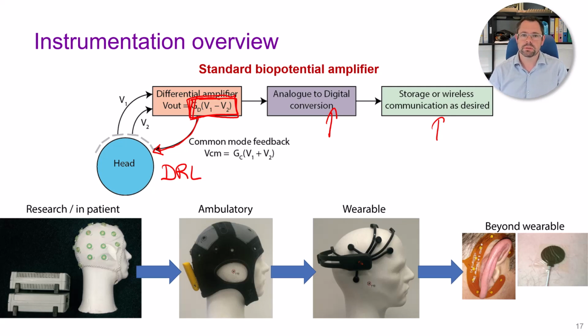The net result of that is that to set up a basic EEG recording, to get one channel, you probably need 3 electrodes. You're going to have the site you want to record from, you're going to have your reference, wherever you've put that, and then you're going to have some driven right leg as well. If you're using a unipolar montage, you need one more electrode for each channel that you then want to add in, because the DRL and the reference are going to be the same ones across all of them. You don't need a separate one to be added each time.